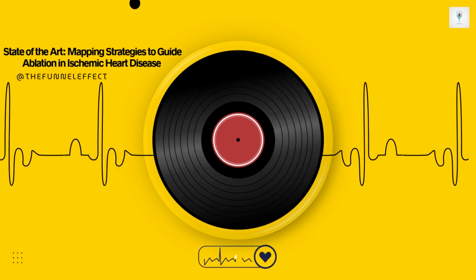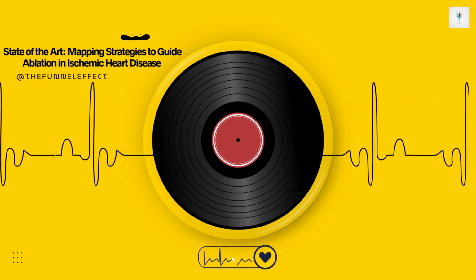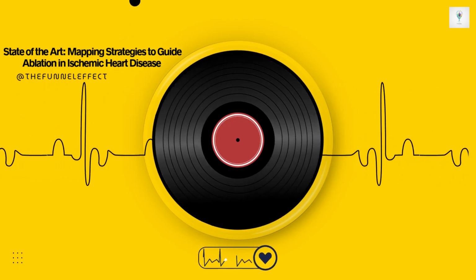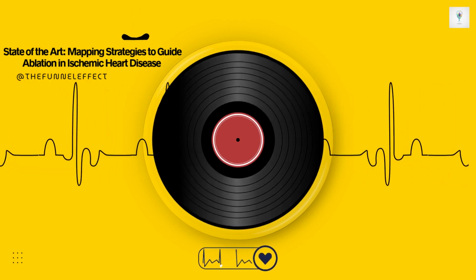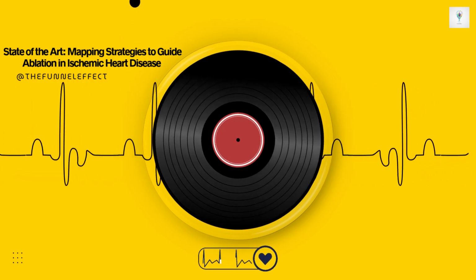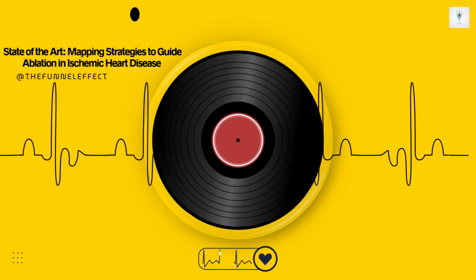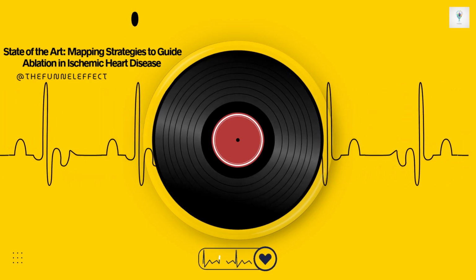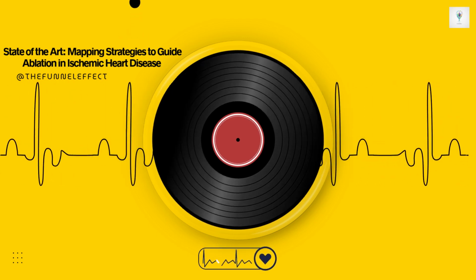Okay, but let's not forget the downsides of PS, the risks, and maybe getting too much information. Definitely. The cons are serious. First, safety. Inducing VT, especially fast VT in someone with a weak heart, can cause blood pressure to plummet, trigger ischemia, even lead to cardiac arrest. It's inherently risky. And then there's the complexity issue. Often you can induce multiple different VTs in the same patient, maybe 4 or 5 different QRS shapes, different speeds. Right. The really tough question then becomes, which of these inducible VTs are the ones actually causing the patient problems, the clinically relevant ones? Which ones match what their implanted defibrillator, ICD, has actually shocked them for?